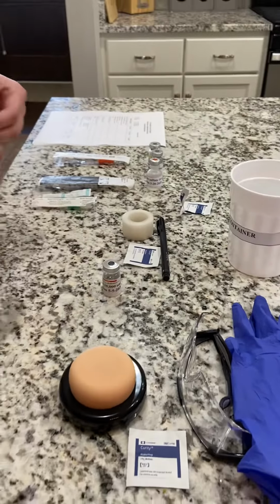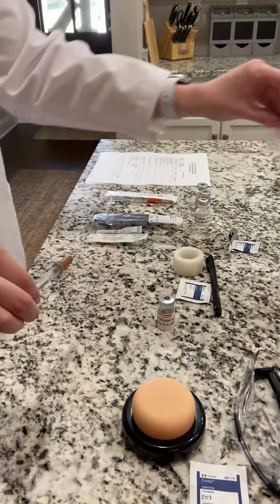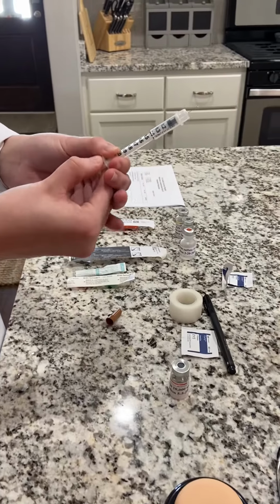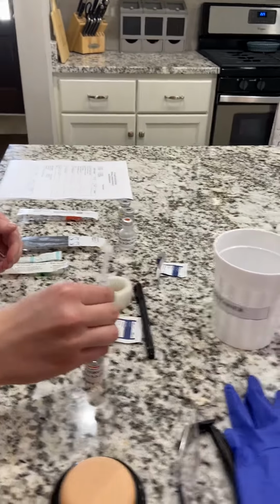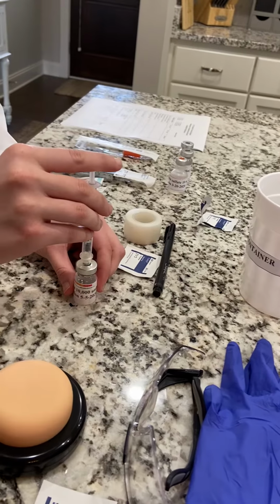Okay, now I'm going to open the syringe package, take the syringe out, uncap the syringe, and now I'm going to draw back 0.5 milliliters of air, and put it into my syringe and administer my 0.5 milliliters of air.